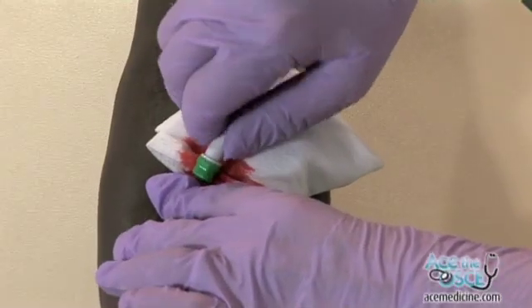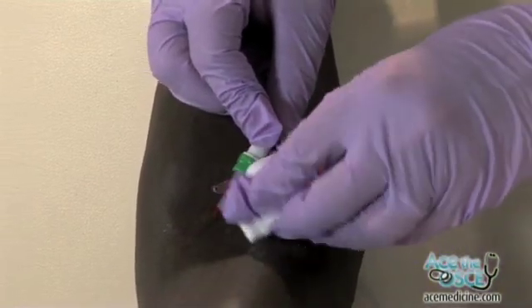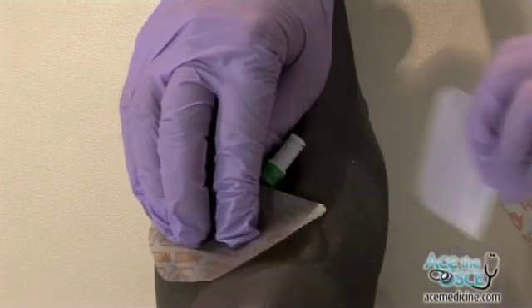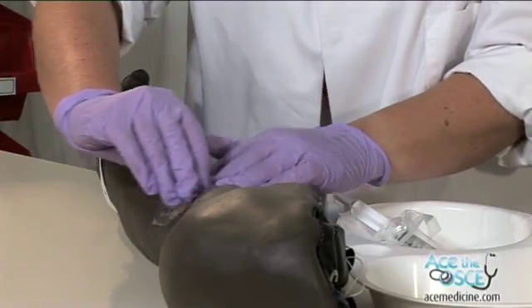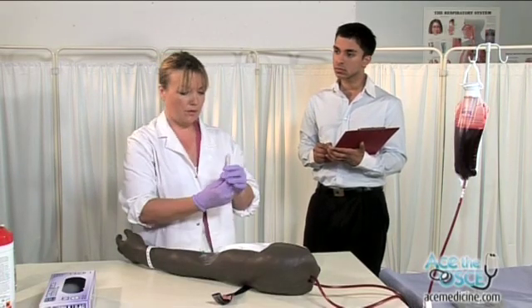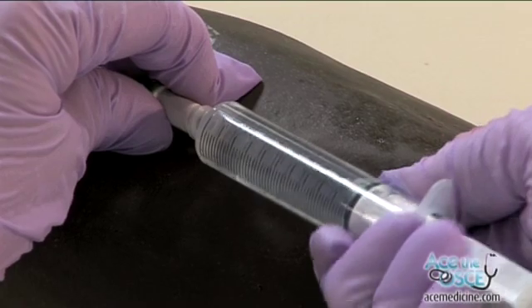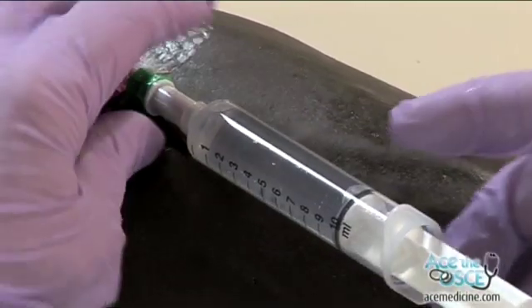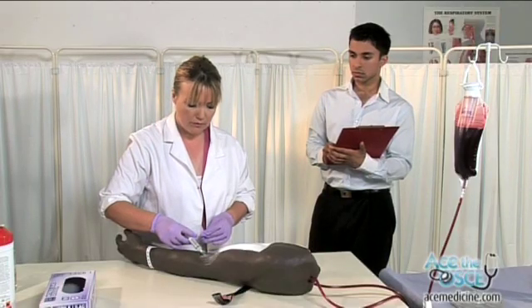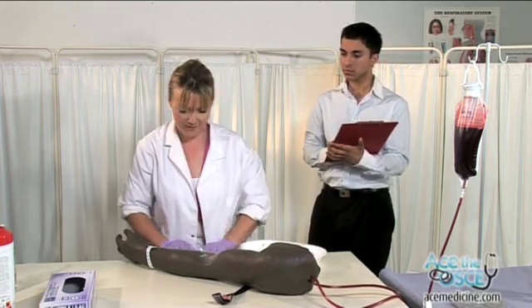Screw in the sterile cap. Remove the gauze and apply the cannula dressing. This may feel a little cold. Screw the flush syringe into the cap and introduce the flush. Thank the patient and make them comfortable. Thank you. Are you comfortable?